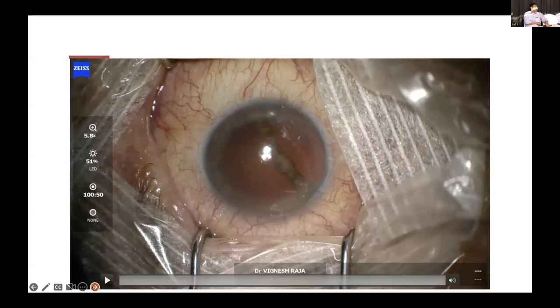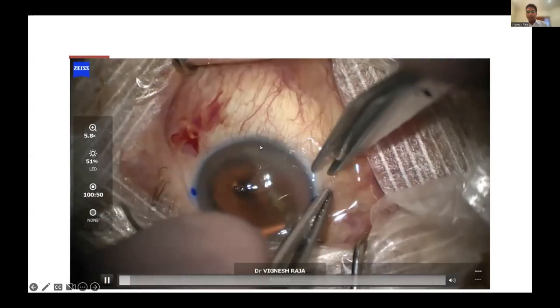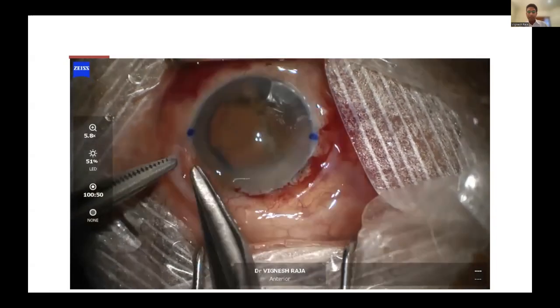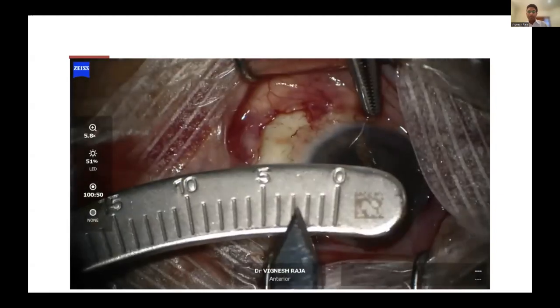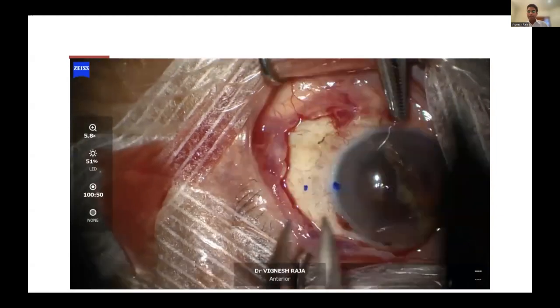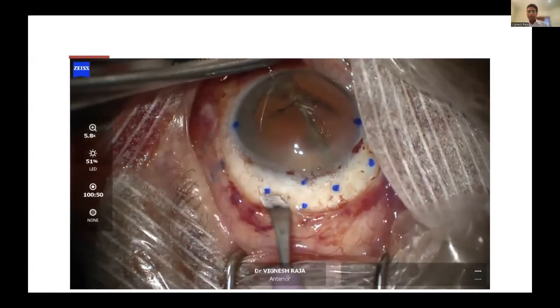So this is a case where, again, there is a penetrating eye injury with no lens. There's just this strand of iris there. And this was something that I could not salvage with any kind of pupilloplasty or anything at all. So this was my third case. Now I've found that the refractive error is much more predictable when you're 3 millimeters behind the limbus. So I'm now marking 3 millimeters from the limbus, and these marks are 4 millimeters apart, so 2 millimeters on either side.